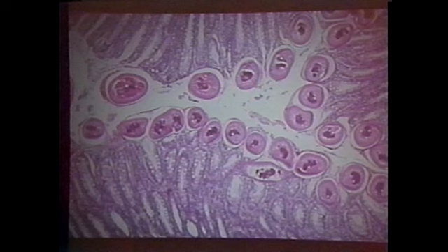And the phasmid nematodes we've gone through have different morphological structures than the aphasmids. Now, you want to know what the aphasmids are? Look in your handout. Trichuris, Capillaria, Anatrichosoma, Trichosomoides. Okay? This group is different because it doesn't have lateral cords. And the other way that it's different is that the female has only one genital tube. But that shouldn't bother you in diagnosis.